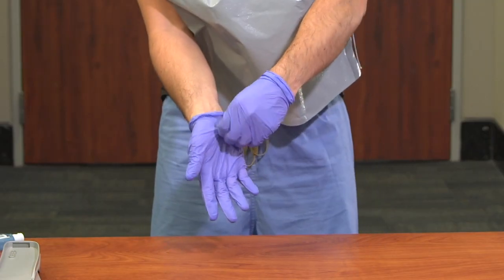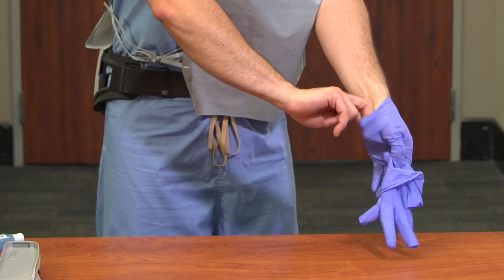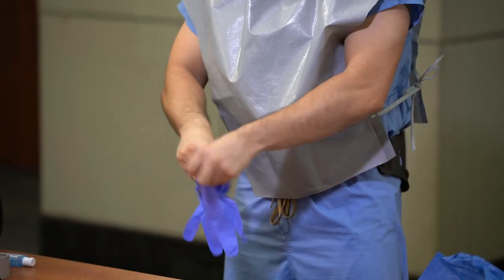Doff gloves using glove-to-glove, skin-to-skin technique, and discard in a waste container. Perform hand hygiene and don new gloves.